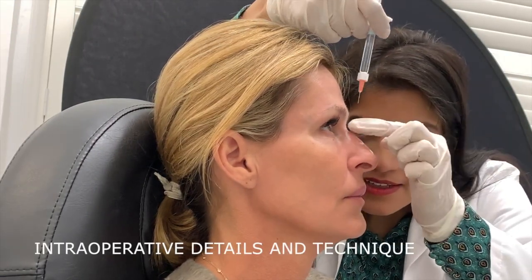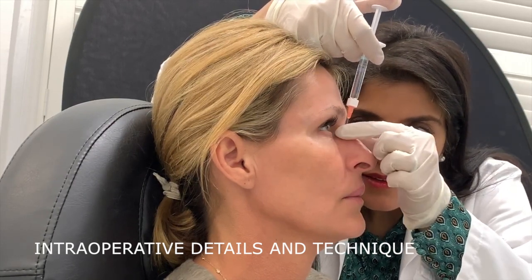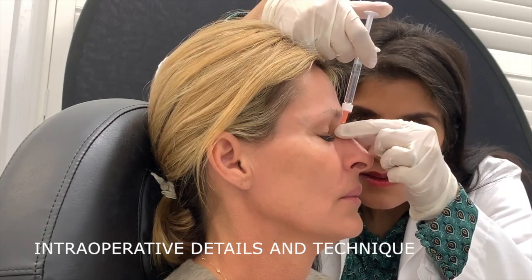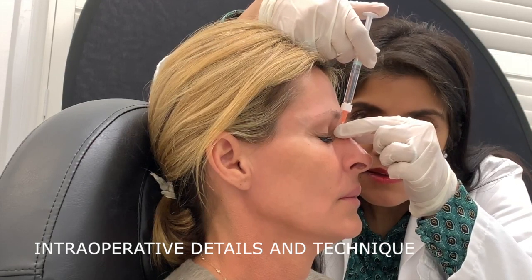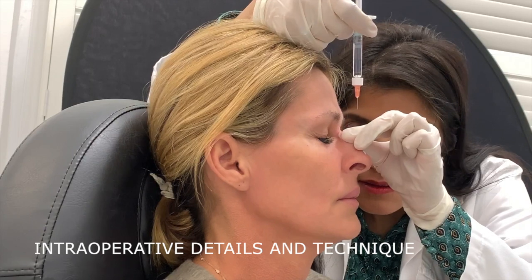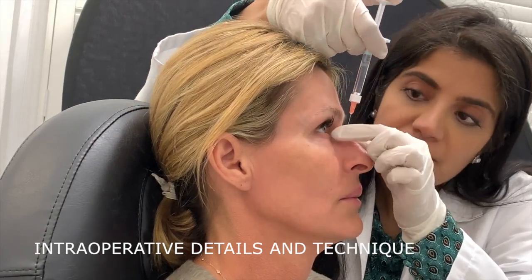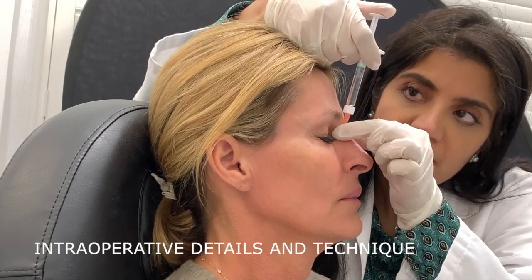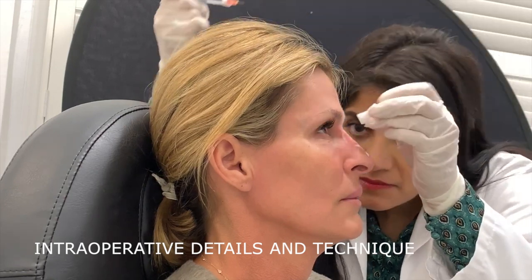When performing a non-surgical rhinoplasty, my key approach is microdroplet injection of a highly dense, highly viscous, high G' hyaluronic acid-based filler. I stay on the midline and stay deep. In addition, I'm always injecting right on the perichondrium or periosteum in an avascular tissue plane just above the bone or cartilage. Prior to injection, I always aspirate for safety and inject on needle withdrawal.